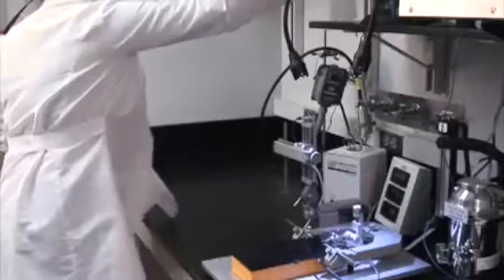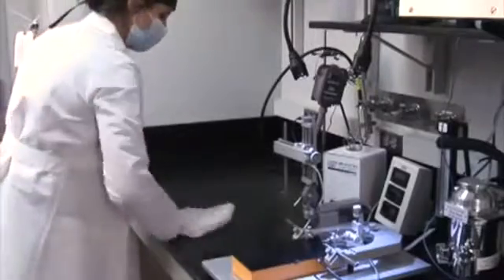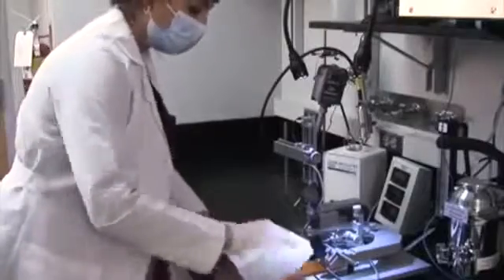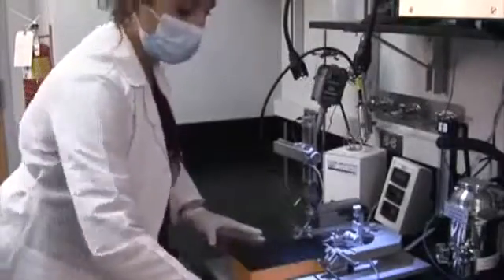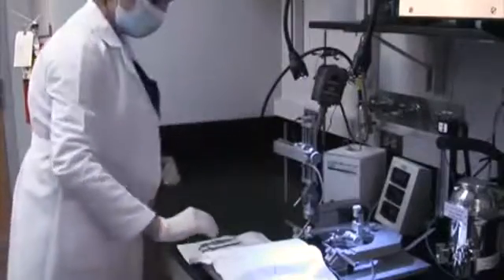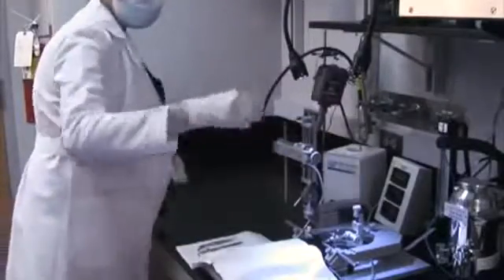All surgical procedures must be performed under sterile conditions using sterile equipment and solutions and according to institution and government guidelines. Details can be found in the text protocol and the institutional IACUC guidelines.